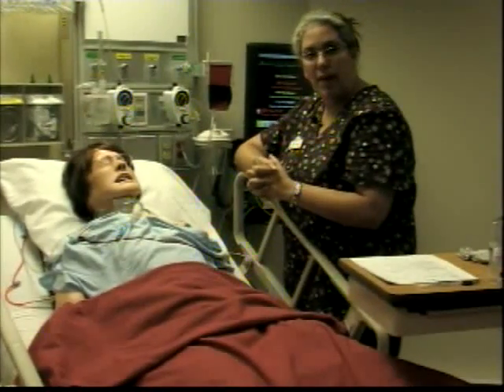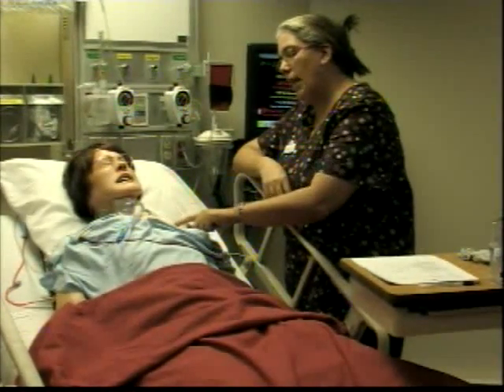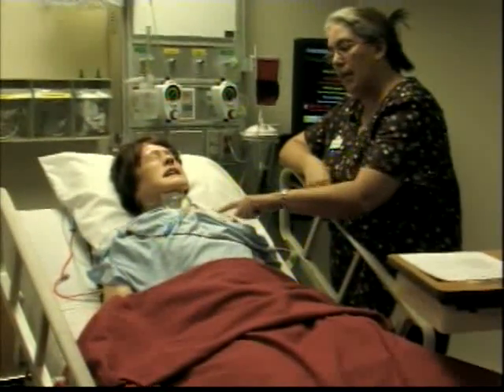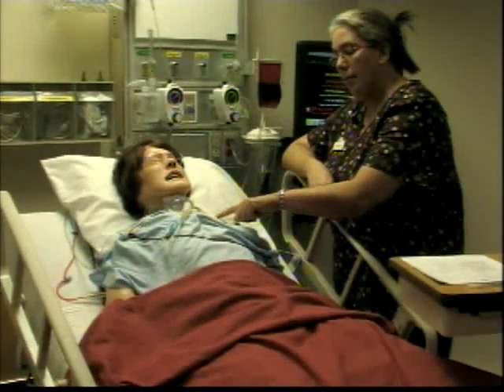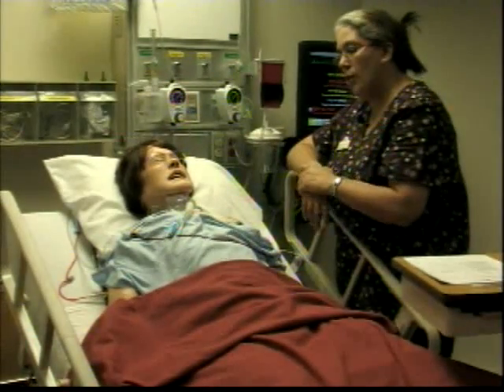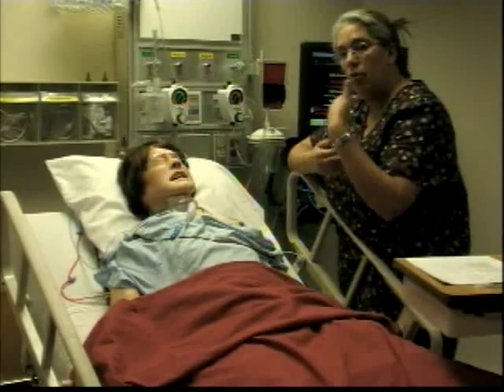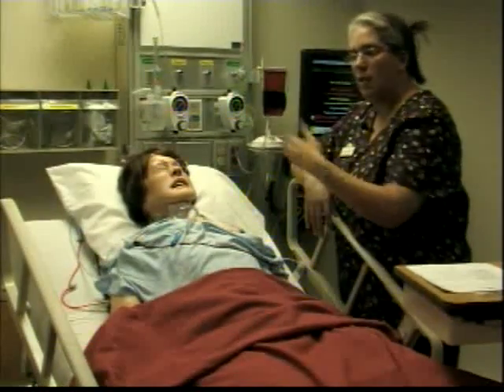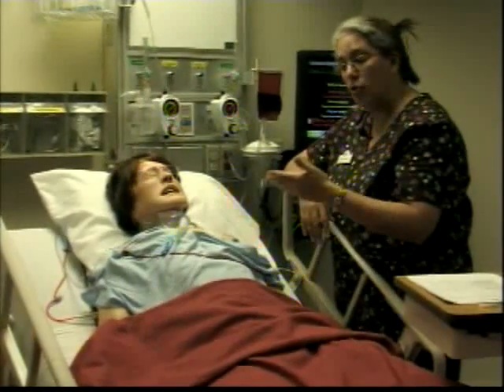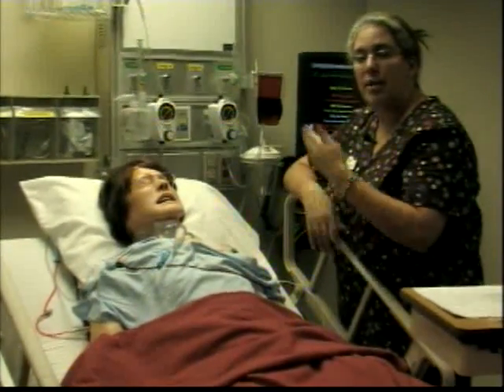So what do you need for that? Remember that this is a line that is placed into a large bore vein, and a vein that can carry organisms, and is a high risk for infection. So you want to make sure that you're not breathing over it when it's exposed, that the client is not, or anybody in the room that wants to stay in the room while you're doing this is not exposing the client.